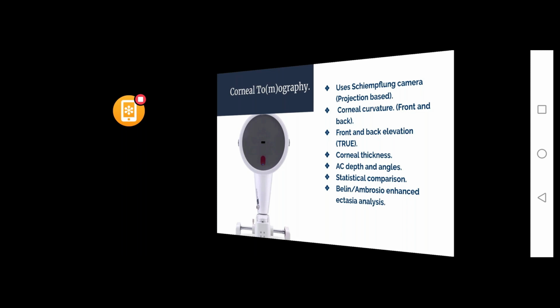The following are the maps about which we will talk throughout this lecture. Before we go ahead with the maps, I would like to ask if anybody has any doubts. If anyone has any doubts, please feel free to ask.